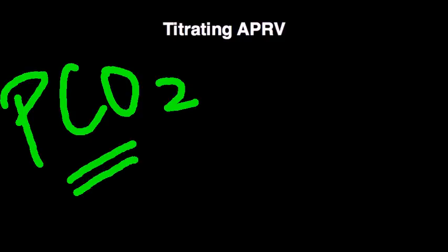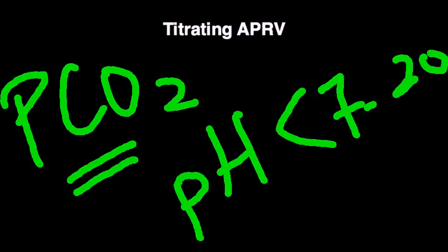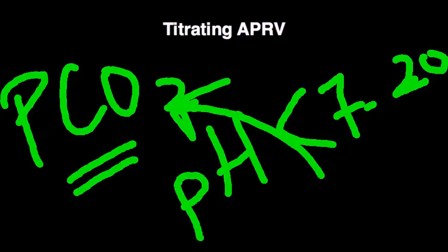Now just be cautious as well, especially with pH levels less than 7.2. This is a situation you really want to avoid, especially in patients who are hemodynamically unstable, on vasopressors and so on. You want to at least keep the pH above 7.20. So while permissive hypercapnia is acceptable, just be cautious to maintain the pH, and don't give them boluses of bicarbonate or IV bicarb pushes, because that will convert to CO2 eventually and increase that burden.